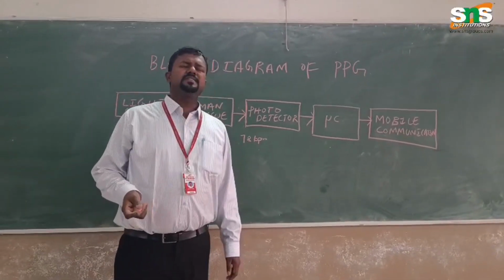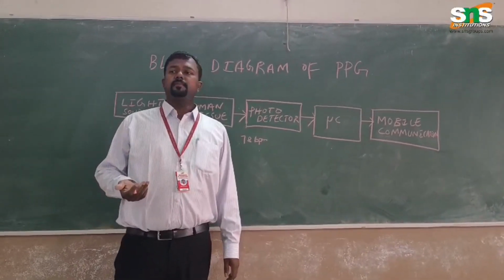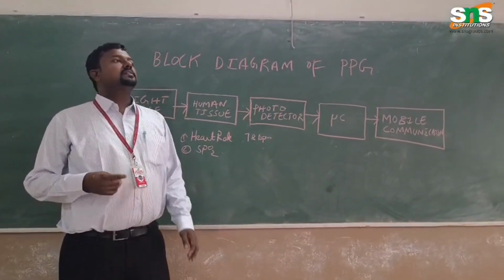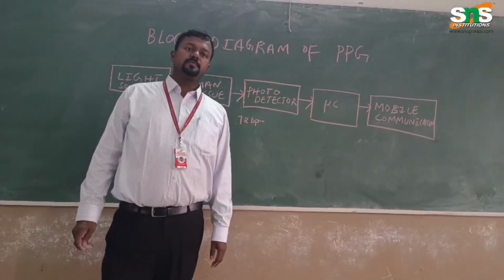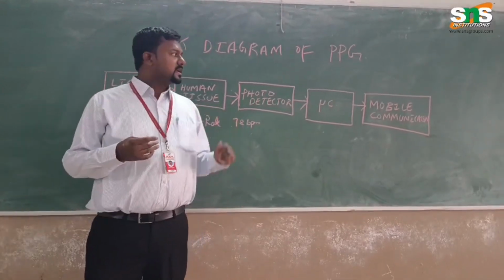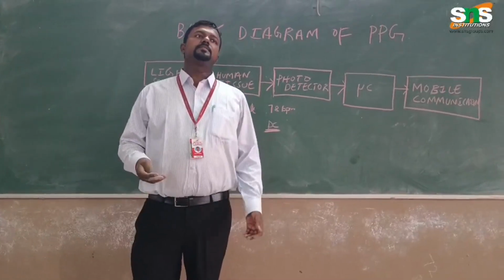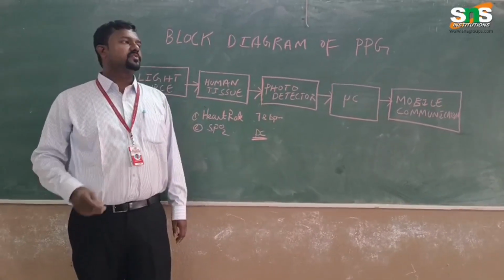Wearable technologies means different kinds of sensors which are used to monitor the parameters very easily and very quickly also. When we speak about the PPG module, the entire cost of this PPG module is very less, because it is a one-time investment and there is no service replacement, because these types of PPG modules purely work on DC batteries only. Once the battery is finished, we can change the battery. Unless there is extensive damage, there is no need for any service.